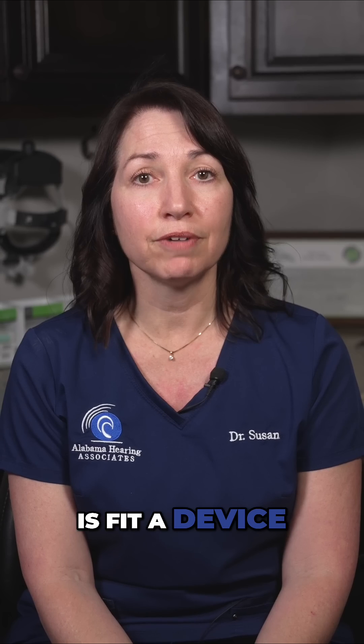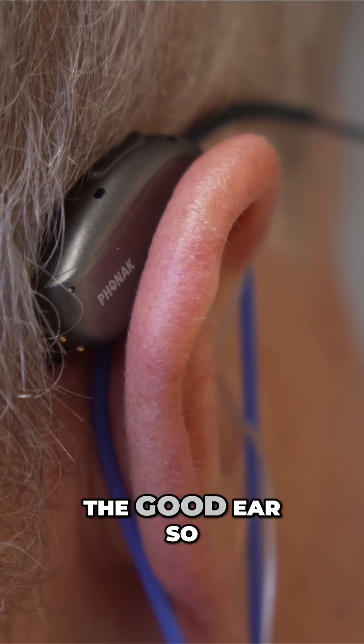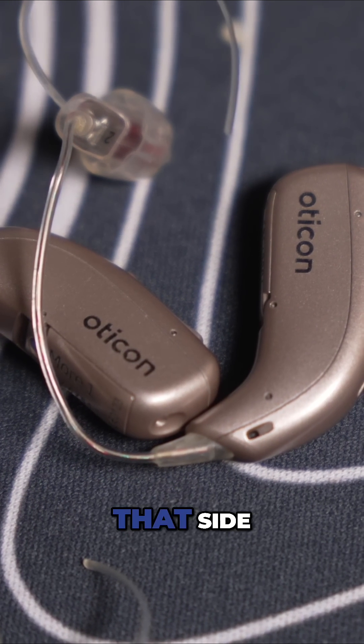What we do is fit a device on the ear that has little or no hearing, and we cross the sound over to the good ear, so that you can be aware of sounds on the side that has poor hearing.